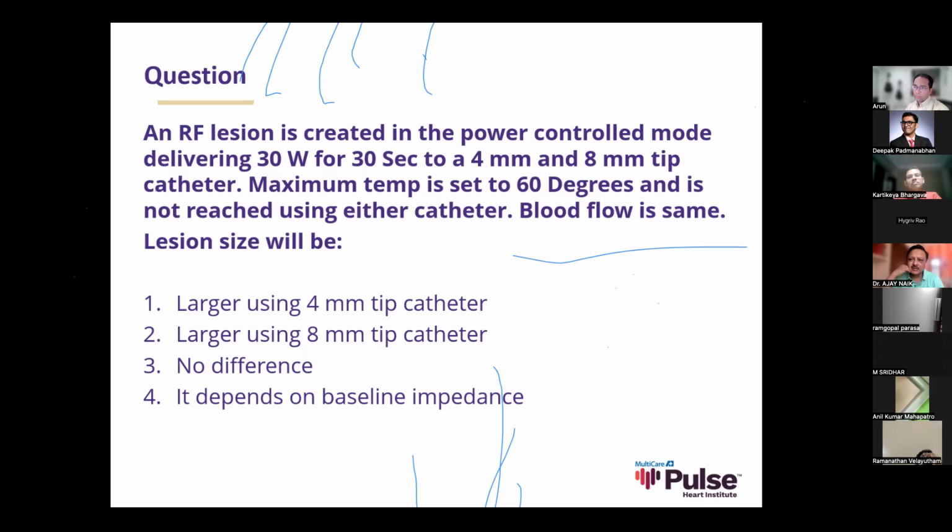In the 80s, okay. And during ablation there is no issue, even though the grounding patch size is relatively larger compared to the body surface area than it is in adults. Does it really have so much of an impact? That is what I'm asking. Clinically, I have to go by what you're saying, so it probably doesn't have a lot of impact.